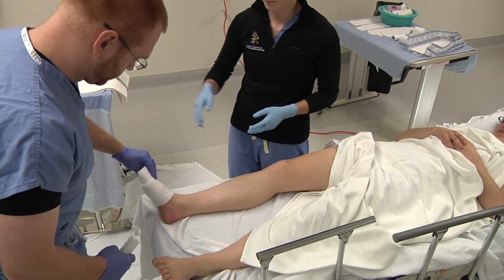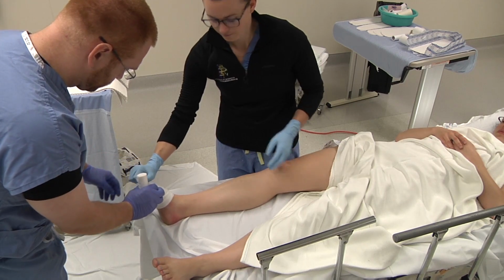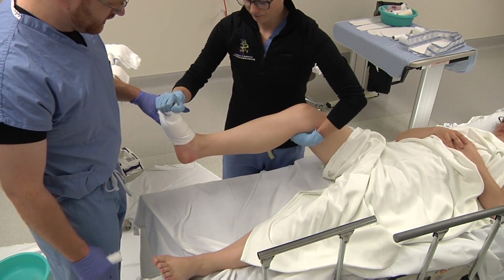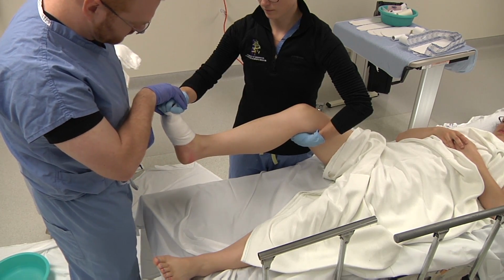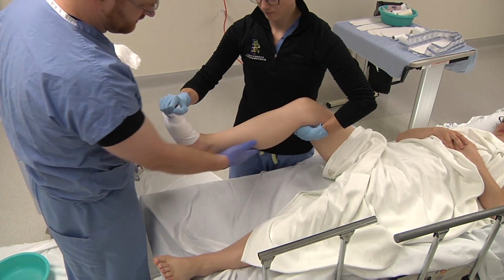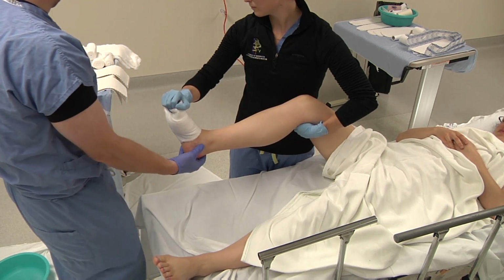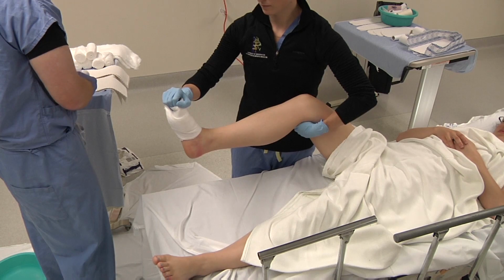From here, Dr. Thayer can grab the toes. You can actually grab on the outside. Good. And the holder position is very important for their ergonomics as well as patient comfort. One hand is grasping the toes, holding the leg up, and one is underneath the medial thigh, bending the knee, taking the gastroc soleus out of our deforming forces, generally of our fracture distal at the ankle.